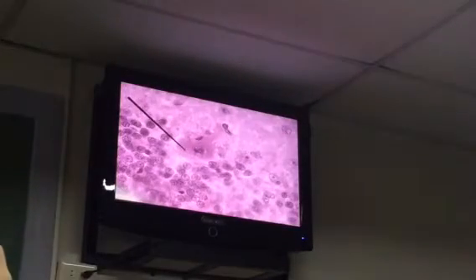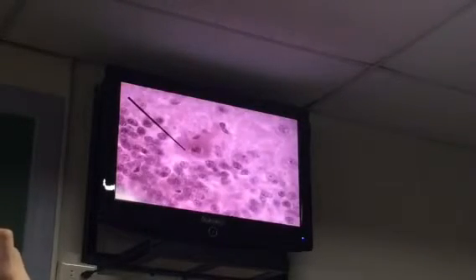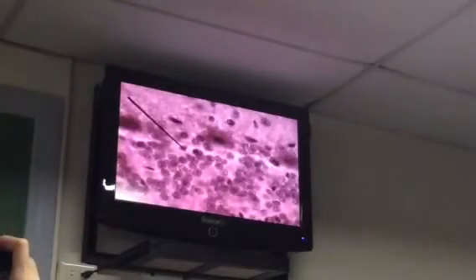The characteristic appearance of your Purkinje cell, by the way, is flask shape. Parang yung flask natin, chemistry. Note again the prominent nucleolus within a nucleus. So that is another clue that you are looking at a neuron.